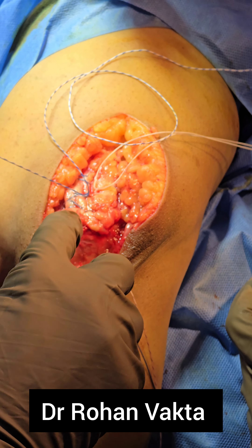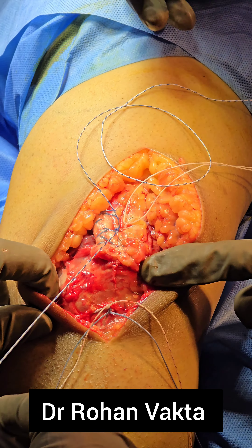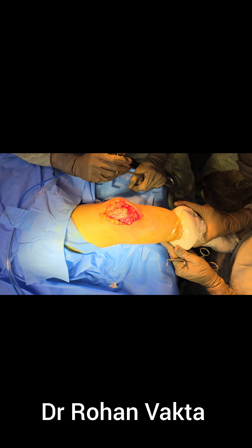One by one all the fiber wires are tied. Once they are tied, the remaining ends are cut — a crossover closure can be done but is not required, as extra fiber wires and knots can sometimes cause irritation and infection. On the table, check the safe range of motion, and postoperatively you can start mobilization.